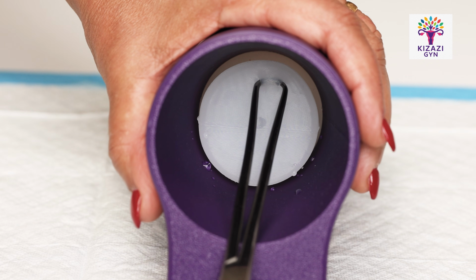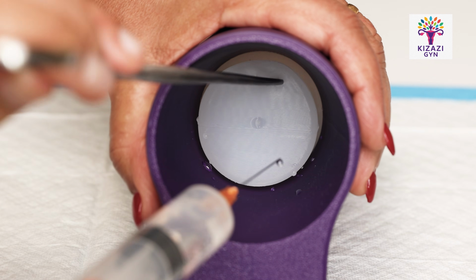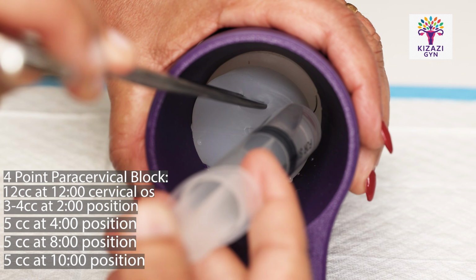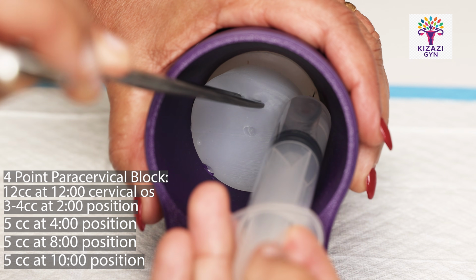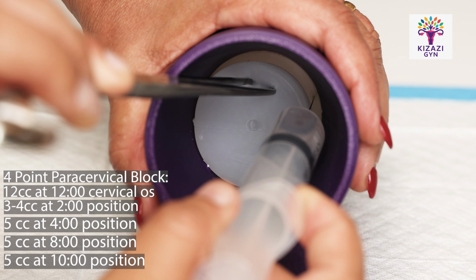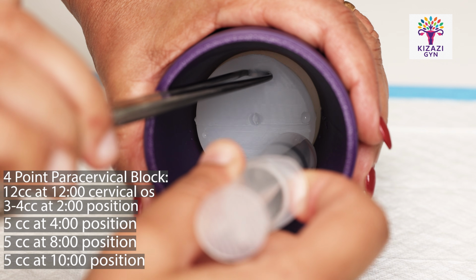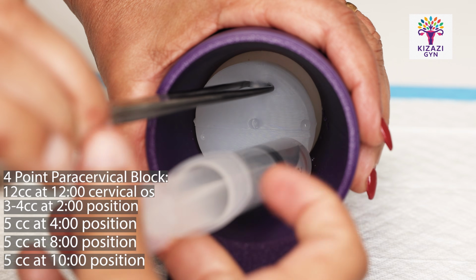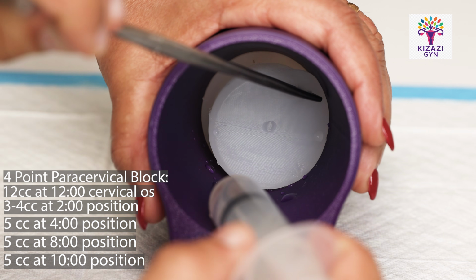Now let's practice a 4-point paracervical block using the more advanced cervix. Here again, you see you really have to manipulate the cervix using the tenaculum. You're able to inject 1 to 3 centimeters at the 2 o'clock position, aspirate, and inject. You're going to come out again. Use that tenaculum to give you better visualization. Inject 1 to 3 centimeters. You're going to aspirate and inject at the 4 o'clock position. Then you're going to come back.